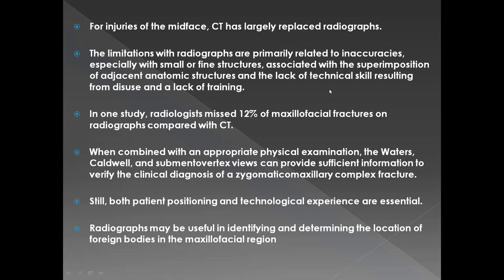Okay, so we have a question here. CT is gold standard, but if anyone asks us about it, we do operate on basis of radiographs in many cases. Yes, that is very true. And for exam purposes, if you come across a mid-face fracture, I would always recommend that you ask the examiner for a CT scan, because you are always supposed to order the gold standard. If the gold standard is not available, then obviously you will have to rely on the X-rays that you have.